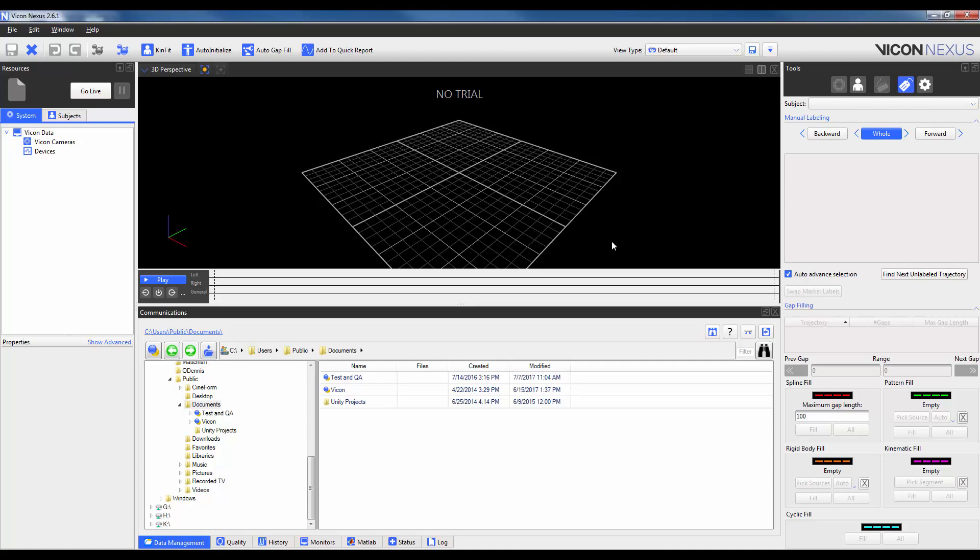Within ProEclipse, the most important functionality to understand is the organization of your data. Nexus requires a hierarchy that begins with a database. While the database is ultimately just the start of the path of where you are going to store your data, many users like to create different databases for each researcher or research group.